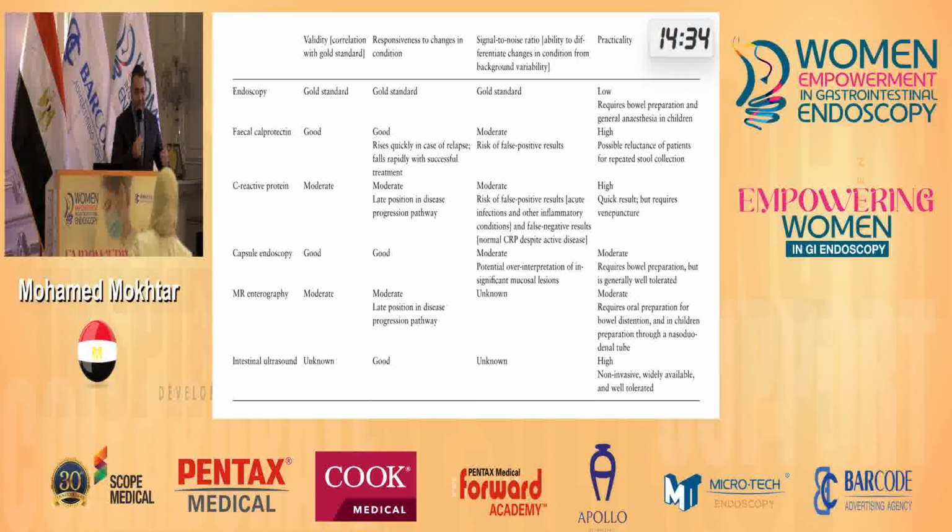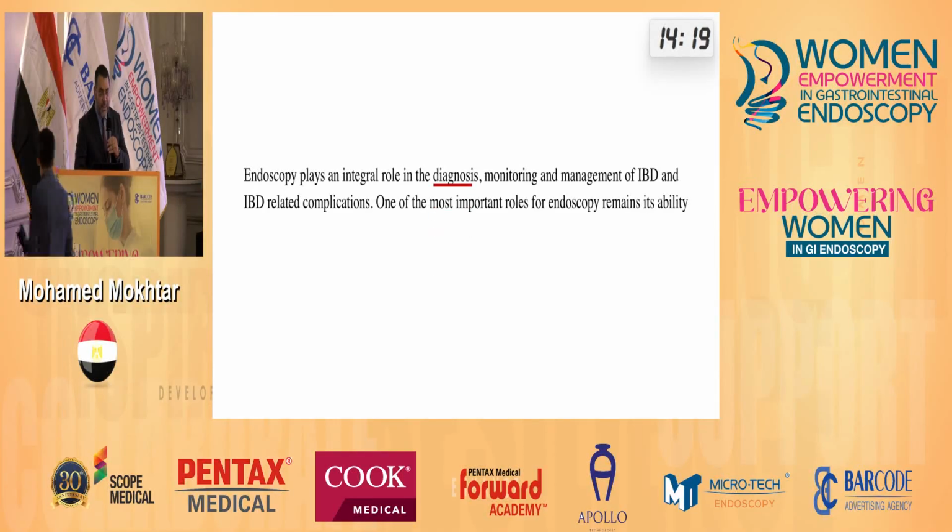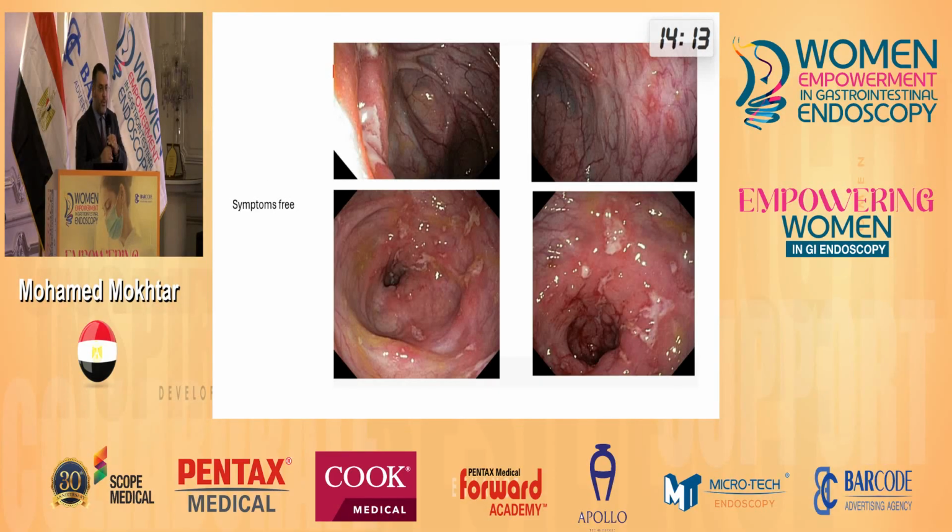Despite the advances in biochemical markers, biomarkers, and radiological investigation, in IBD patients endoscopy and colonoscopy remain the gold standard. It's not just a matter of diagnosis; it's diagnosis, monitoring, and the management plan of IBD. I think we have all faced this situation before: a patient who is symptom-free, in clinical remission, but when you do endoscopy, you find this lesion.